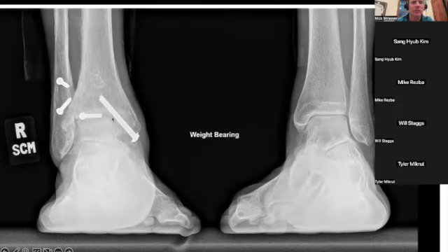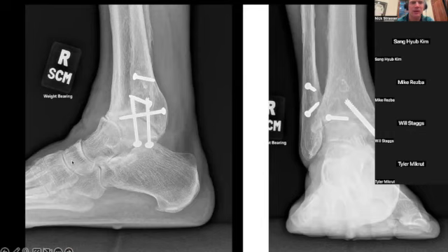I think Jan got on. Bethany, you're on. What are you thinking when you see something like this? These are the x-rays. Here's the 3-view ankle. And the trouble area, I don't have a good picture, is on the lateral side of her ankle. It's interesting that you mentioned the staph infection, and that's really what has me concerned. The x-rays are not very concerning. It shows arthritis, but I'm more worried about if there's some latent infection in this patient.